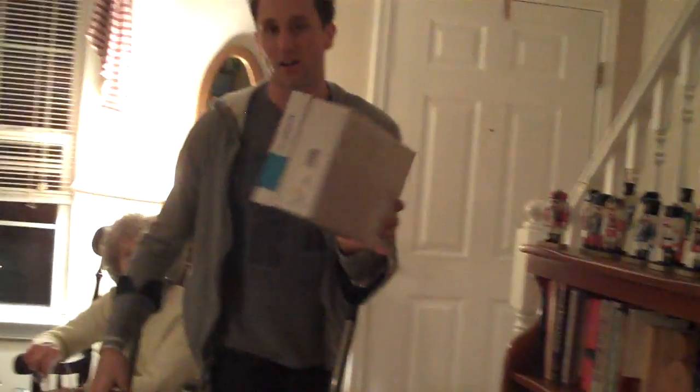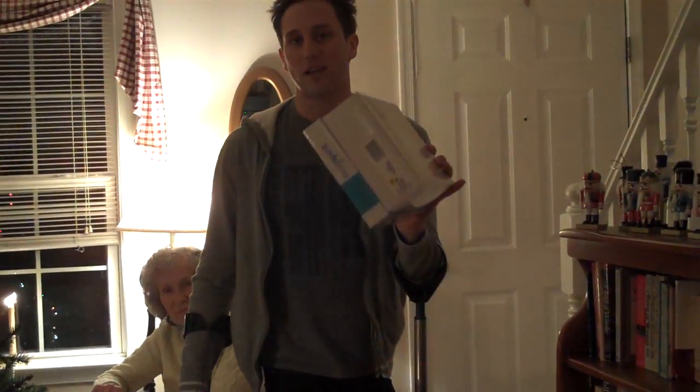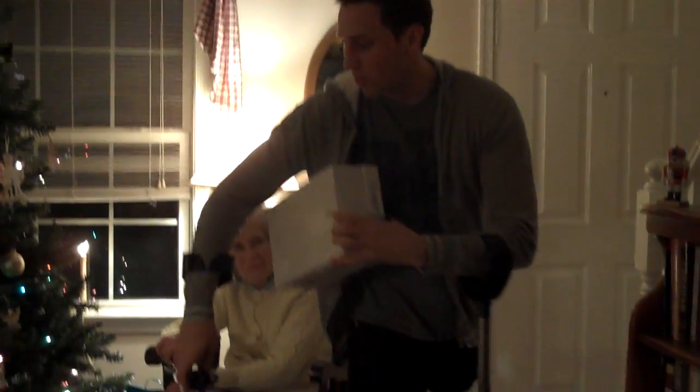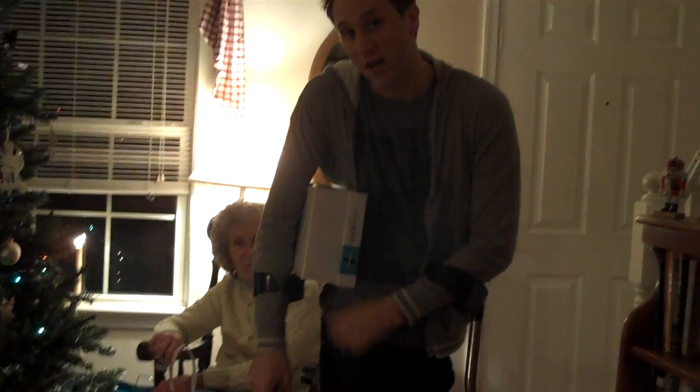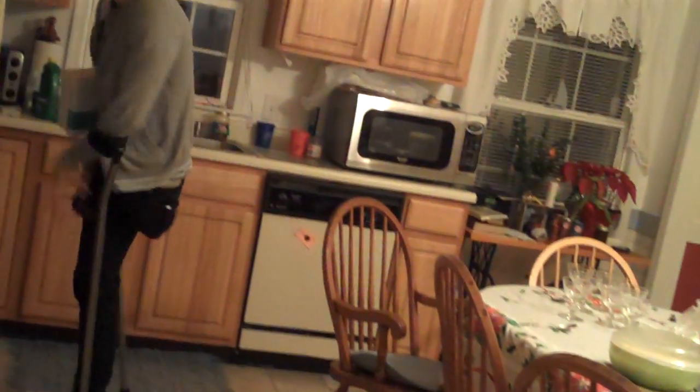Now let's say that we have something a little bit bigger, too big to put my hand around. Here's a secret crutch carrying technique you've probably never seen before. You're going to put it under your arm like this, and then let the weight drop down onto the top cuff of your crutch. When you walk like this, it's not nearly as difficult as you would think.